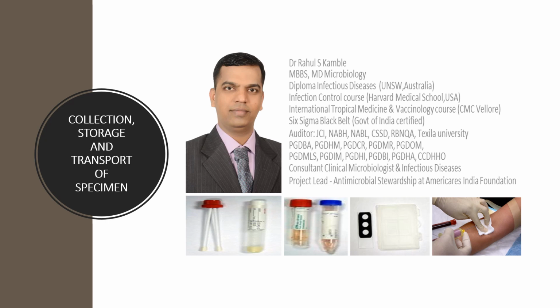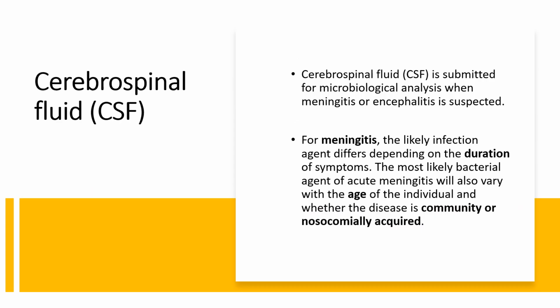Hello, let us continue with our session on collection, storage, and transport of specimens. Let us learn about CSF sample collection and storage. CSF is submitted for microbiology analysis whenever meningitis or encephalitis is suspected.